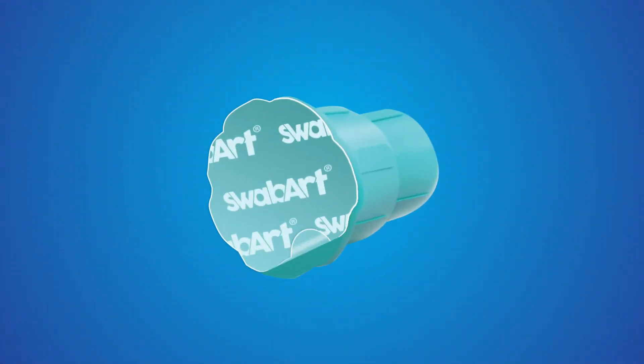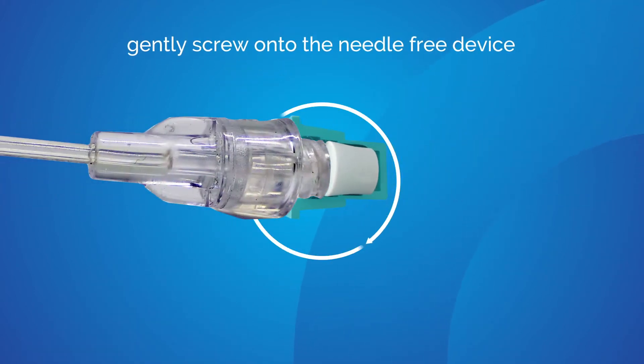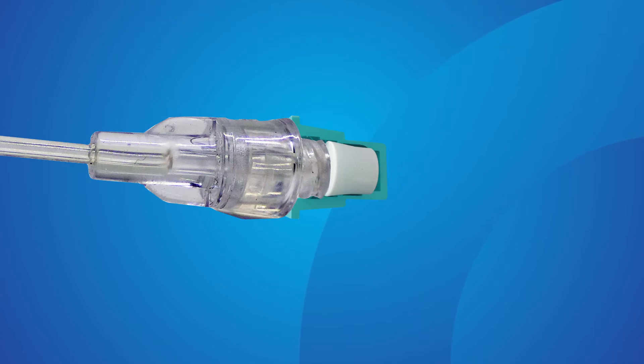To use a SwabArt disinfection cap, simply peel back the protective covering and gently attach it to a needle-free valve. Once SwabArt is connected, its IPA-impregnated absorbent sponge will disinfect the surface of the needle-free valve.